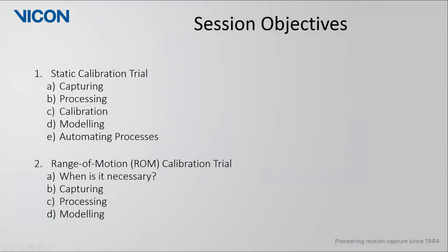In this guide we will look at the workflow for two different types of calibration trials. The first type is the more traditional static calibration trial, while the second type is for a range of motion or ROM trial. For the static trial we will look at the considerations for capture, processing, and calibrating. We will then look at how to model using this template.